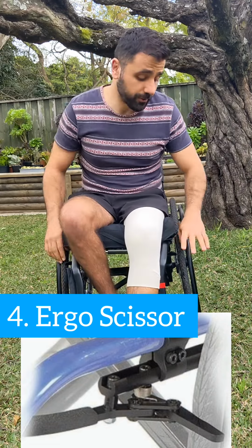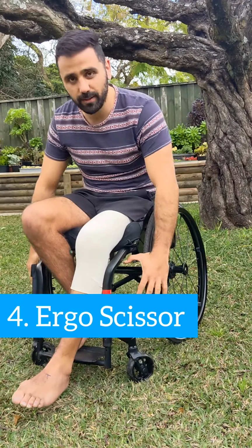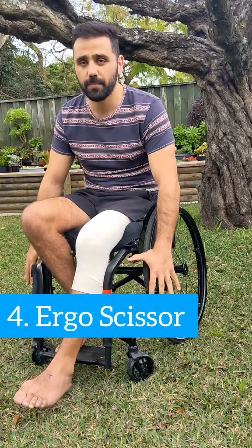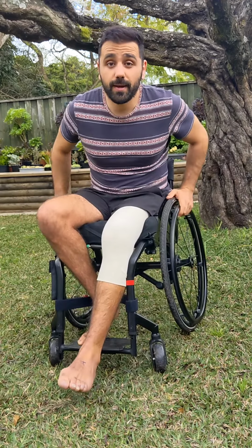They're also really good because they get completely out of the way. So even with these compact scissor locks, they still have something in the way, so if you do have your thumbs out, you could hit them. With the ergo scissor brakes, they get completely out of the way. The last lock I'll talk about are D-lock brakes.